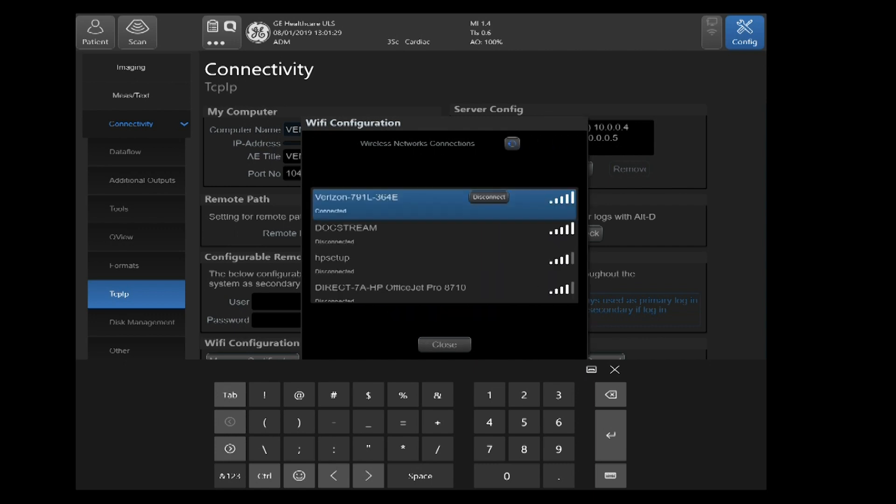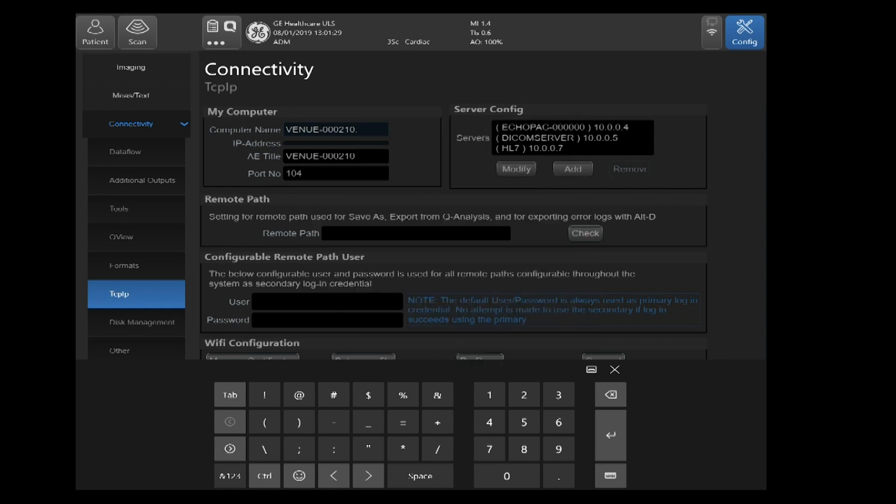It will connect you to your network and you are done with your network configuration for Broadcasting Network.